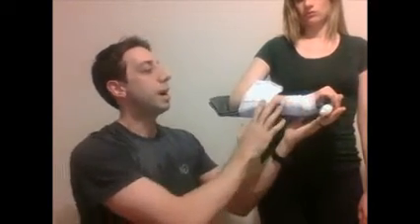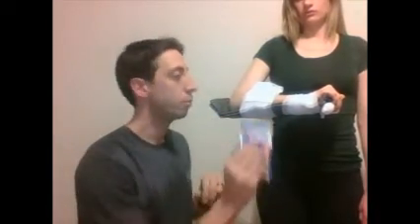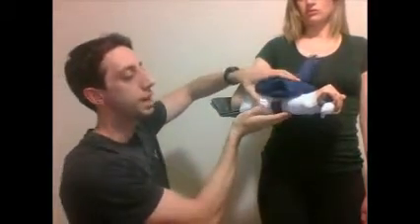Okay. So now the splint is applied, but the patient's still kind of expected to hold their arm in this position, otherwise gravity would just force it back down, right? So we can help the patient in that sense too. Notice I've got my ice pack ready, so we've already done the rest. This is now the immobilize, okay? We can put some cold on it. So you'd want to wrap this in something so it's not directly on the skin. Apply some cold to the injured site.